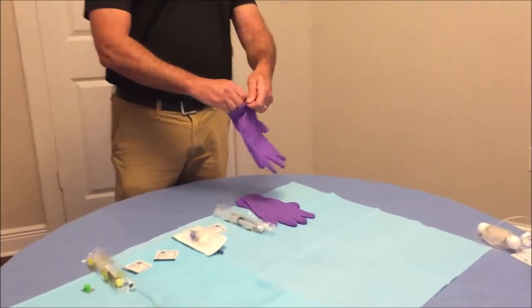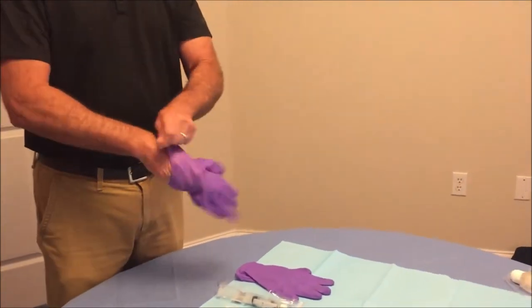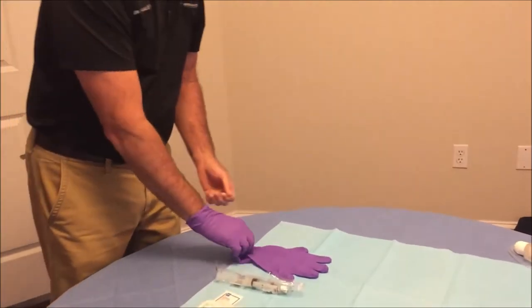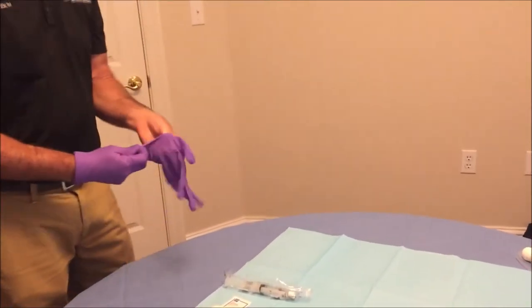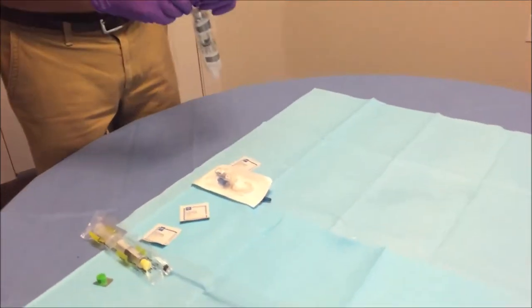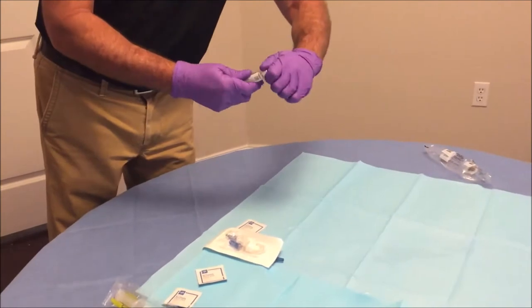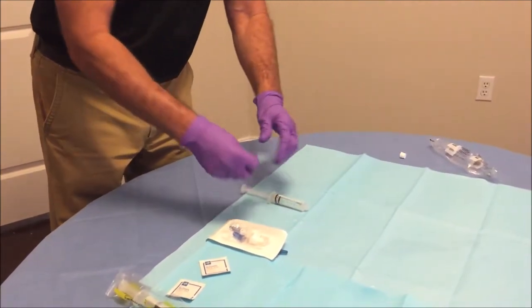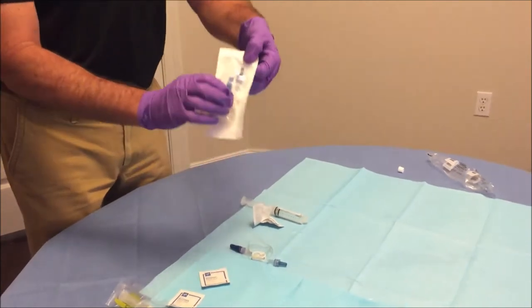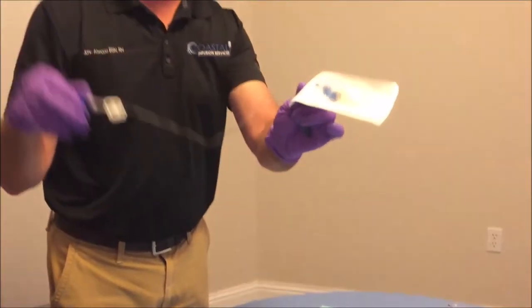So let's get started. After washing your hands for 30 seconds with warm soapy water, put on your gloves and then open your supplies. Take out your normal saline, remove the white cap, open your alcohol prep, and remove your extension set from the packaging.